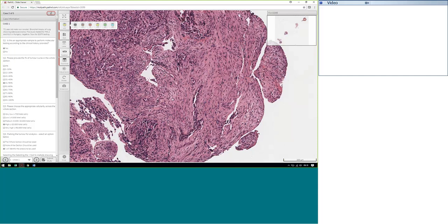So for annotation purposes, we would annotate around each of the three pieces, either as three separate annotations or moving around the three pieces as one annotation.